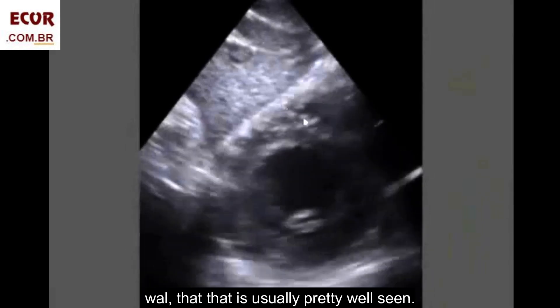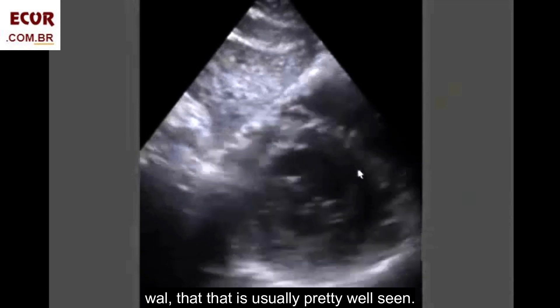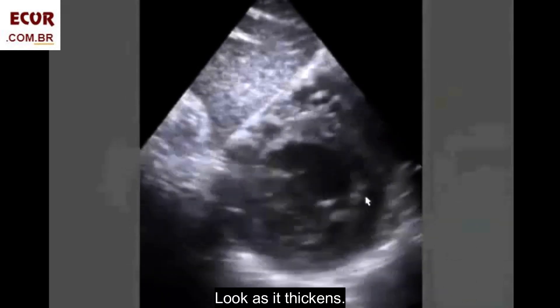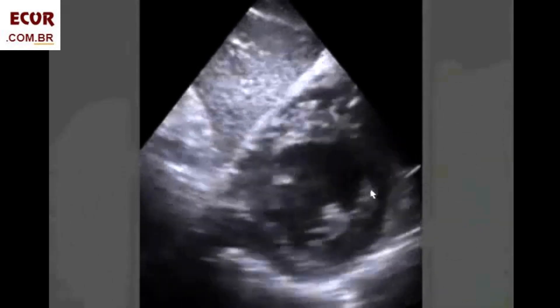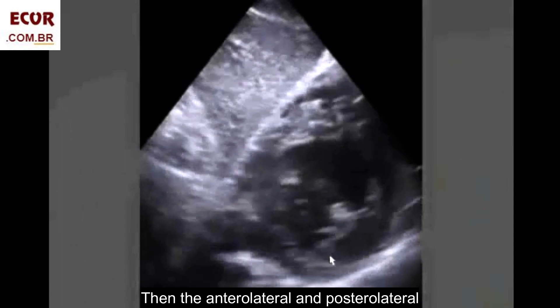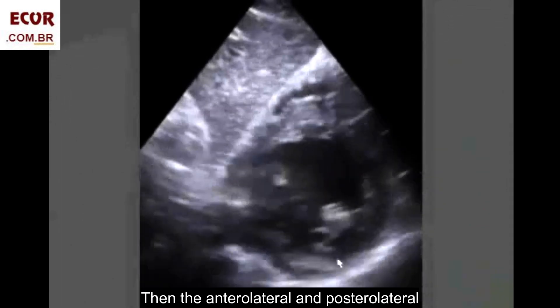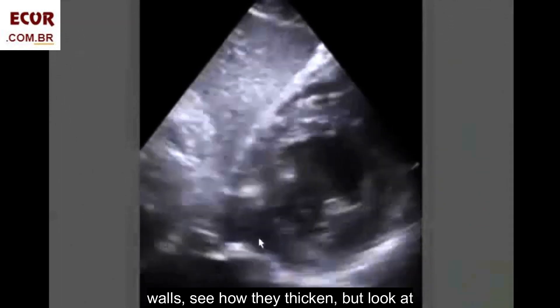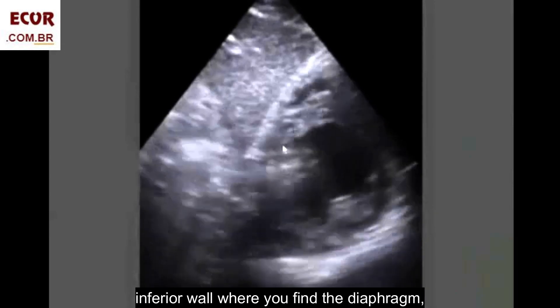Then the anterior wall, which is usually pretty well seen — look as it thickens. Then the anterior lateral and posterior lateral walls — see how they thicken. But look at the inferior wall.